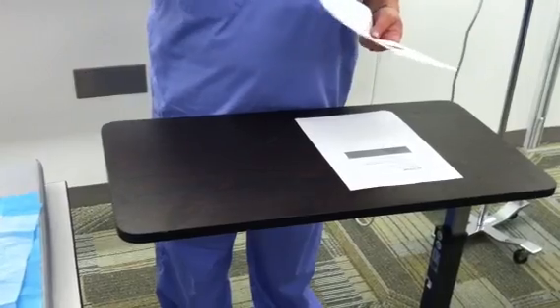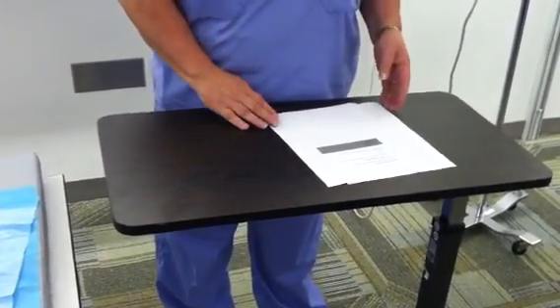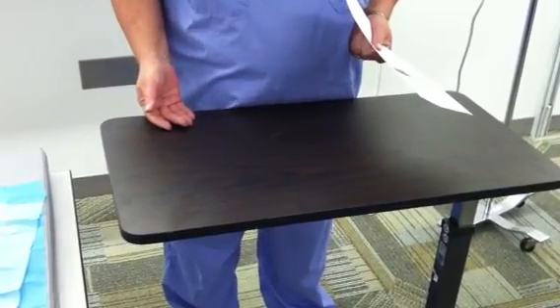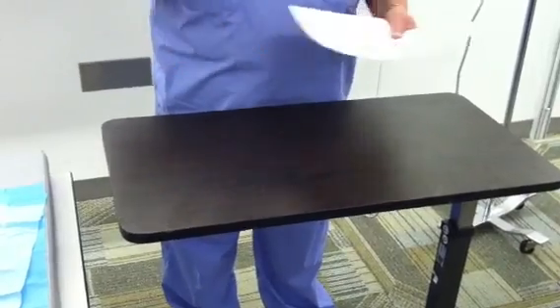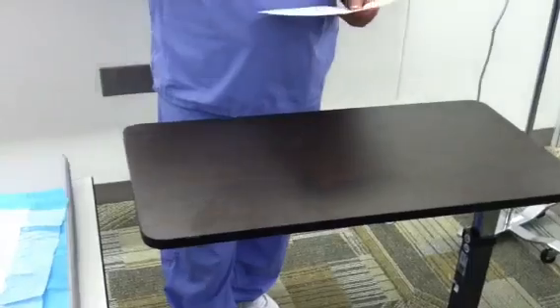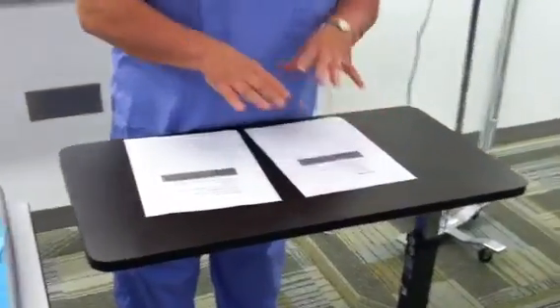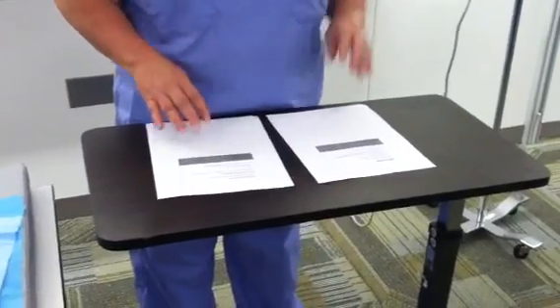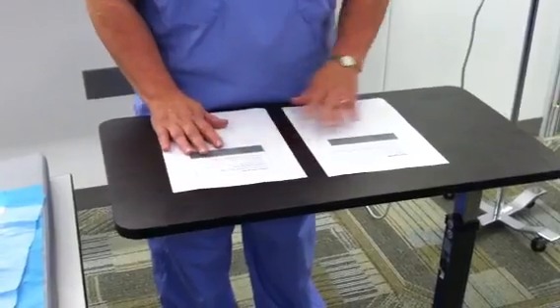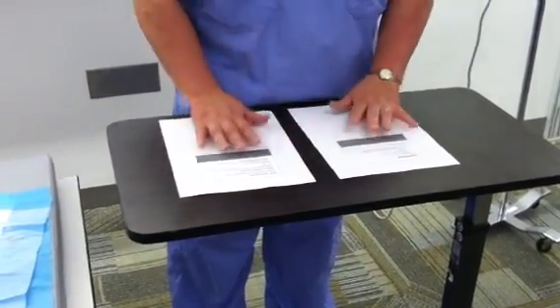Ideally, you would assess your patient to make sure that the medications are safe to give, and you're also going to assess your patient to make sure that they're tolerating the formula okay. And I'd want you to let me know what kind of things you would see if they weren't tolerating it. Then you're going to check your MAR against the physician's orders. Remember, you want to look at the patient name, the patient birth date, the medications and the formula order on the MAR, and you're going to make sure that is exactly what the physician wrote, and it matches perfectly.